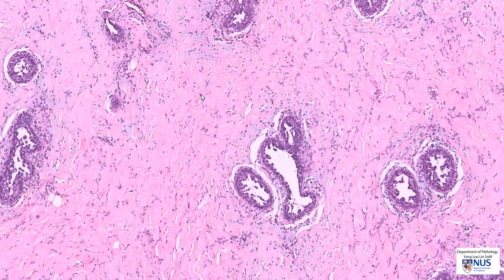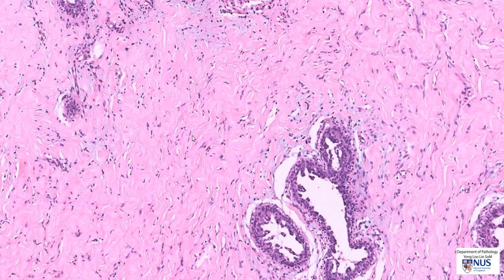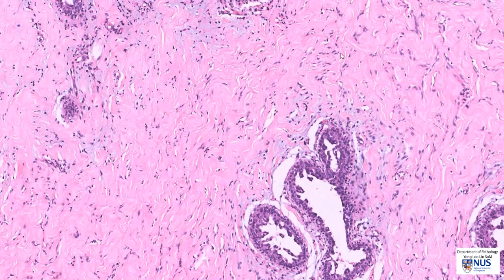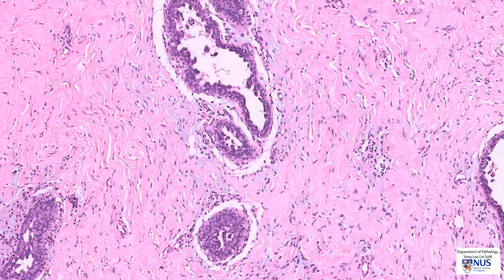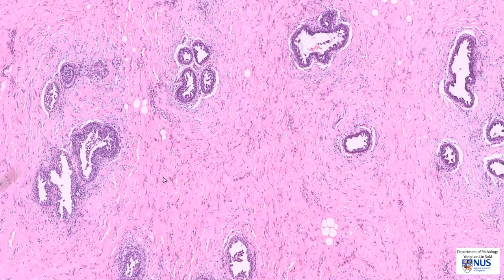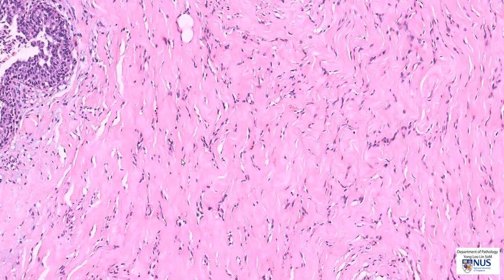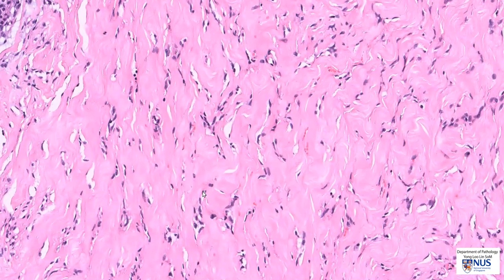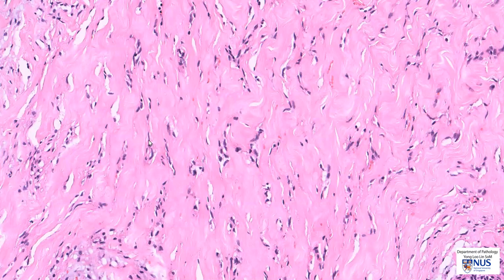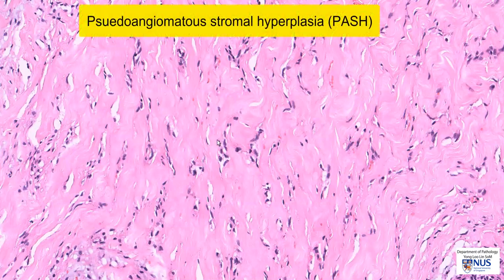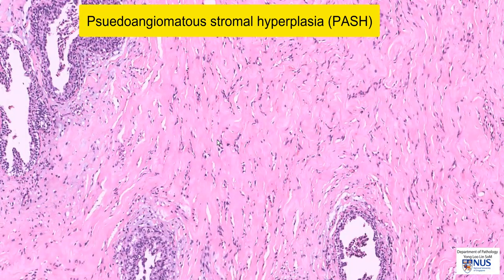In the intervening stroma, we can see a lot of pink bundles of collagen. In some areas, we can appreciate quite a few spindle cells within the stroma. Some of these spindle cells appear to line slit-like spaces, resembling blood vessels but they are not true blood vessels — we don't see red blood cells within them. This appearance of slit-like spaces lined by spindle cells is known as PASH, which stands for Pseudoangiomatous Stromal Hyperplasia, a frequent phenomenon seen in gynecomastia.